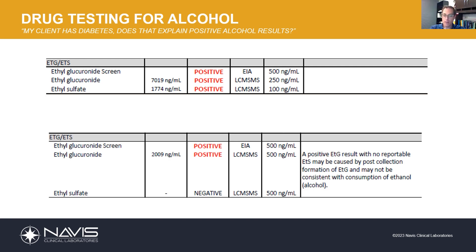In another scenario, we have a positive ETG screen where ethylglucuronide is detected but ethylsulfate is negative. This is an unusual scenario, and we flag it on our final reports: positive ETG result, no reportable ETS — may be caused by post-collection formation of ETG, and may not be consistent with consumption of alcohol. So be looking out for that flag in your final report. If you see it, it's a possibility that you've got a diabetic who had a UTI or a yeast infection and they fermented that ethanol.